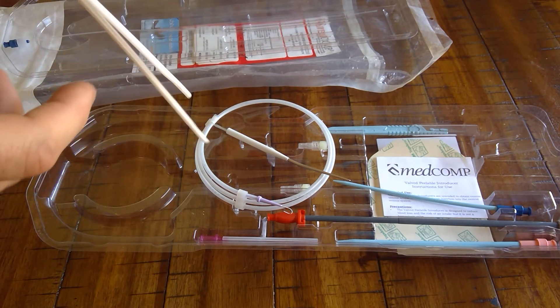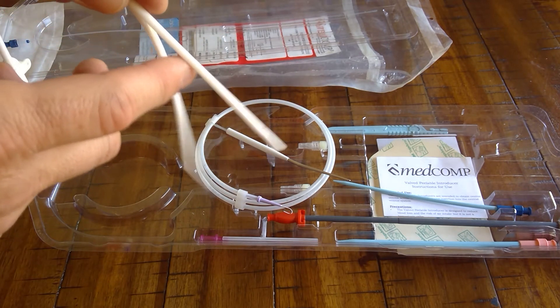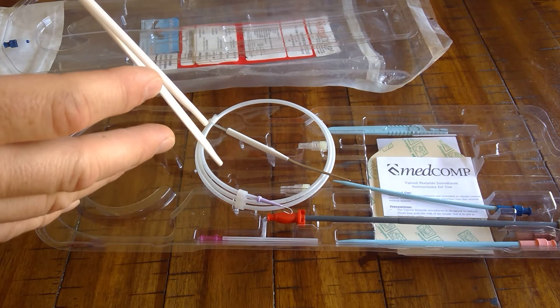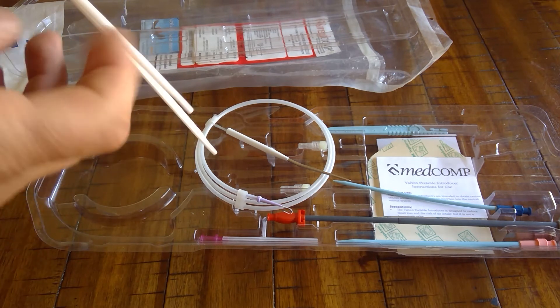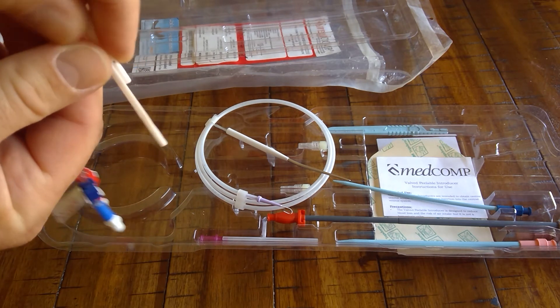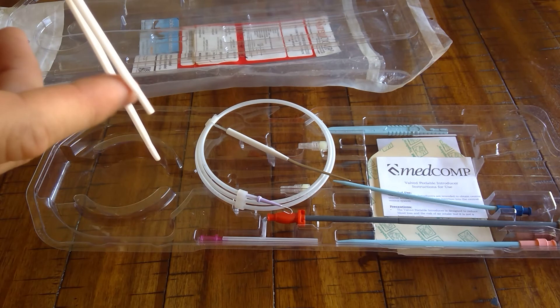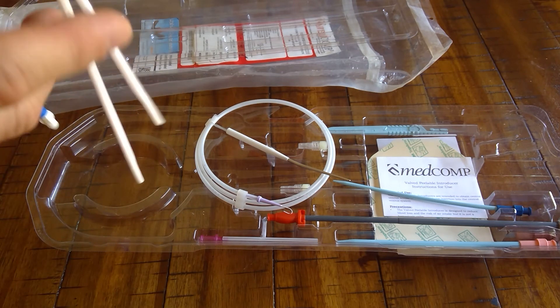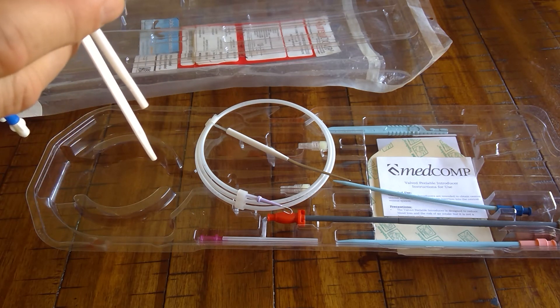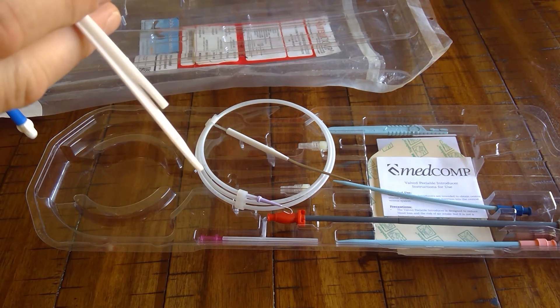The reason this is such a good catheter is that the lumens inside the patient are separate. The two separate lumens move around with blood flow turbulence and the patient's heartbeat, keeping fibrin tissue formation to a minimum. It also eliminates a phenomenon seen with step tips, where the catheter gets sucked up against the atrial wall or superior vena cava. The motion minimizes both fibrin tissue formation and catheter malfunction due to being sucked up against anatomy.